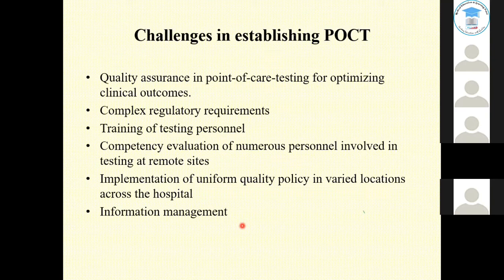Now, this is from what we faced over the last 6 years while establishing maybe one of the first POC networks in India. Challenges in establishing POCT are the ones that we faced while we tried to establish a point of care testing facility in the hospital.